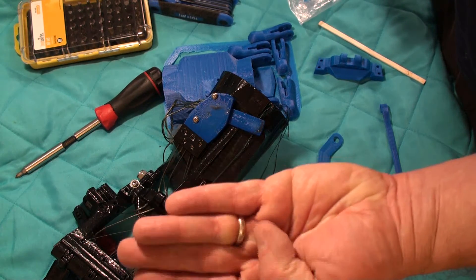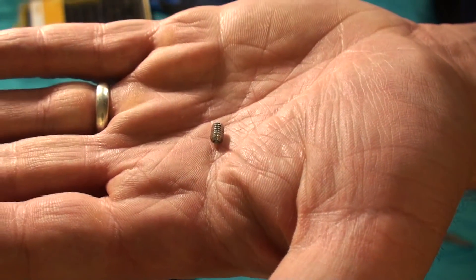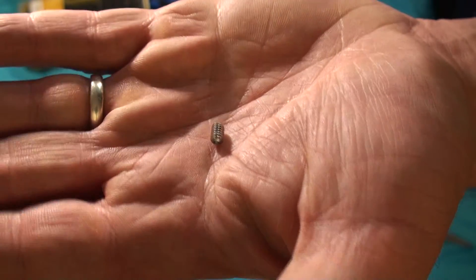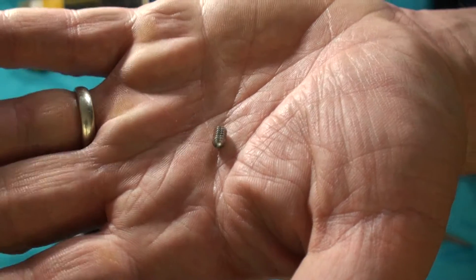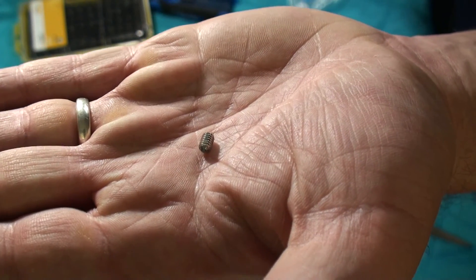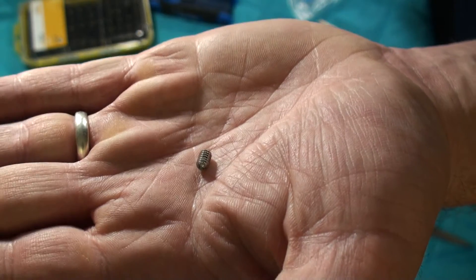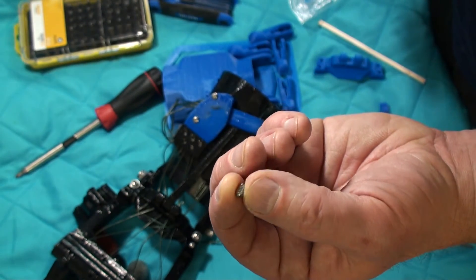This is a little smaller — this is an 8-32. It looks like it's about a quarter inch, so maybe seven millimeters. I don't know, is that an M5? I hope you can find something like that, but that's the set screw.